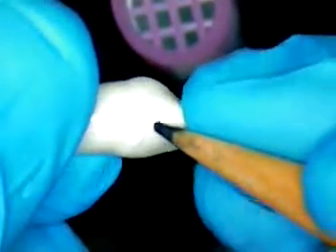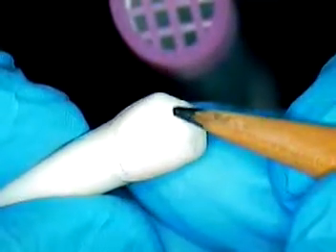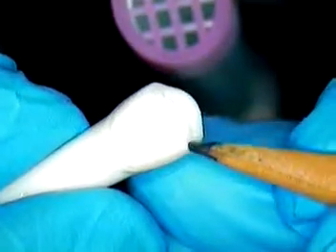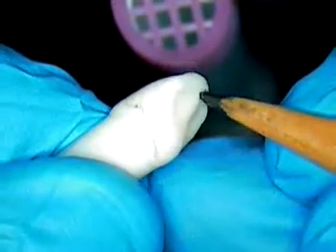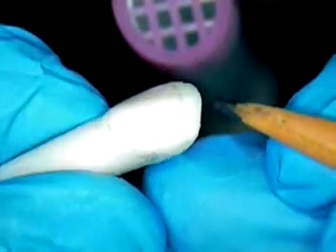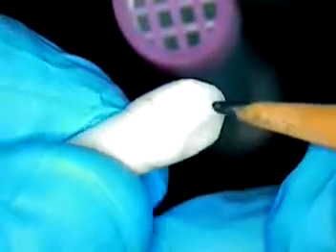As you go toward the back of the mouth, the papilla gets flatter. For the incisal edge we want about two millimeters of reduction. Draw it in at two millimeters of reduction, and you can go ahead and reduce that immediately as well if you'd like, or you can do it progressively. As you're reducing the planes, there are three planes in every tooth reduction. We'll score it and then come back and see how far we did.